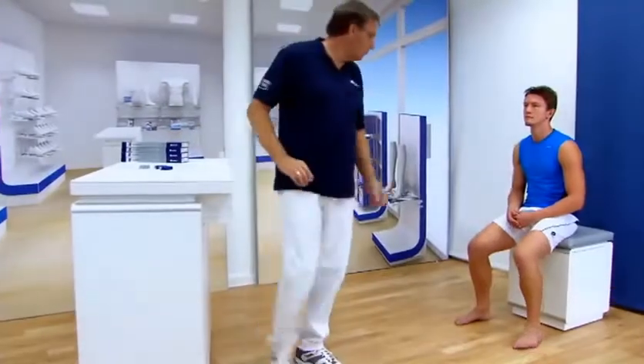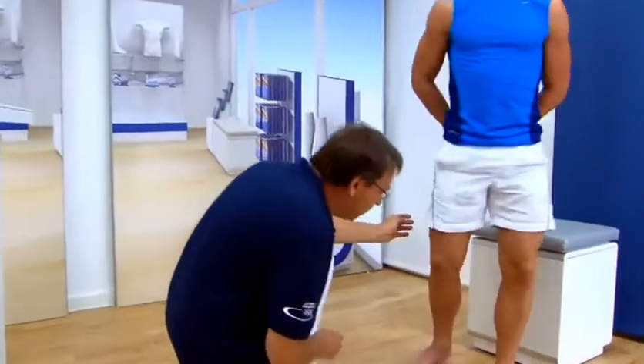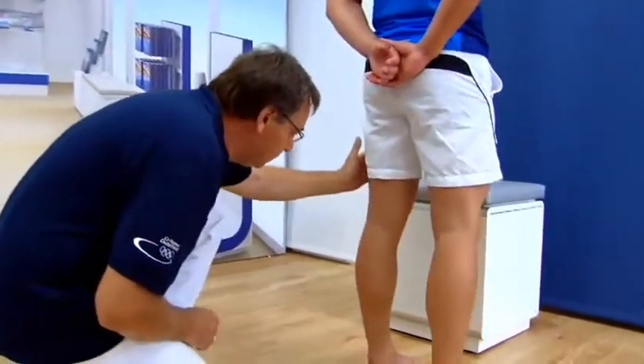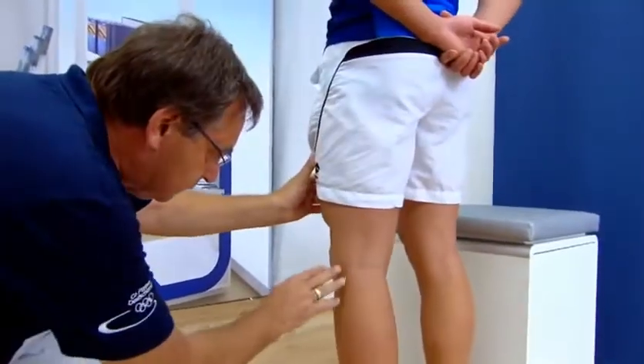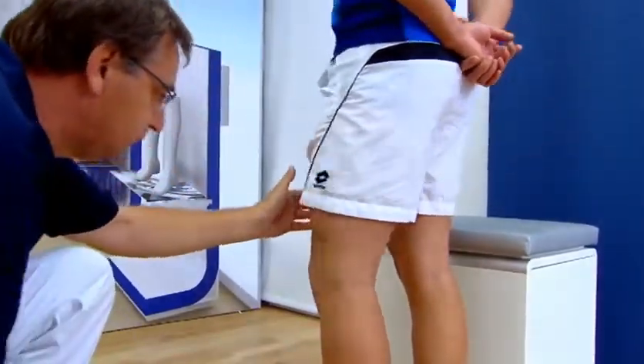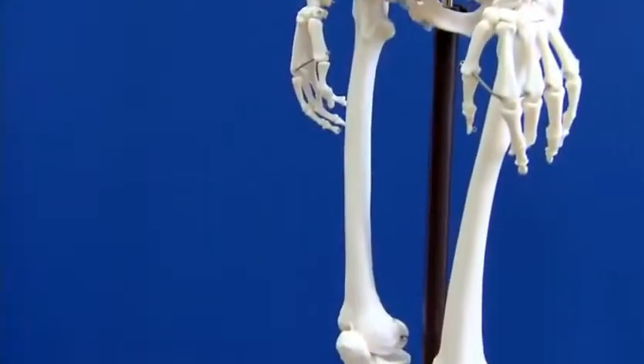During the diagnosis, the affected knee is thoroughly examined following a consultation with the patient to identify any possible circulatory problems, allergies, or skin irritation. Measurements are preferably taken with the patient in a standing position, as long as the patient can put weight on the knee.